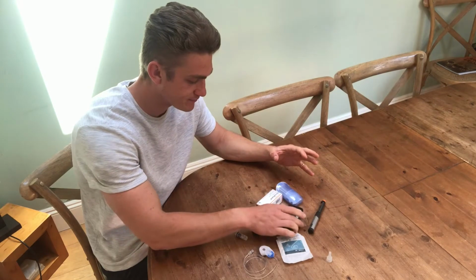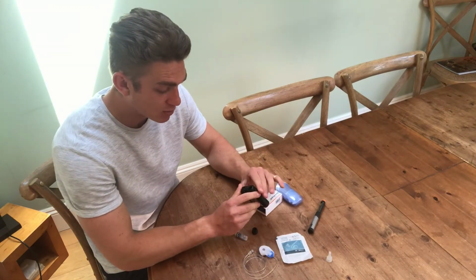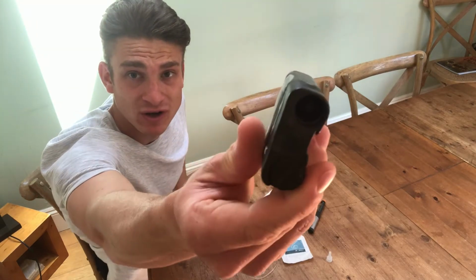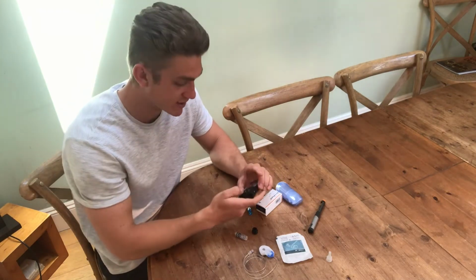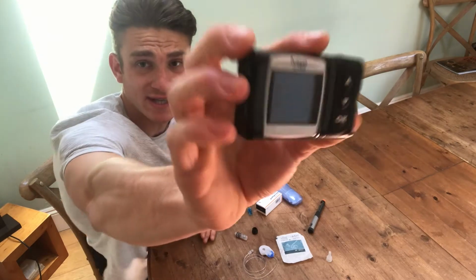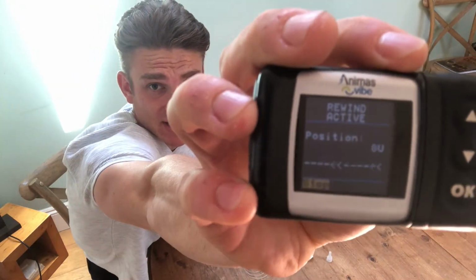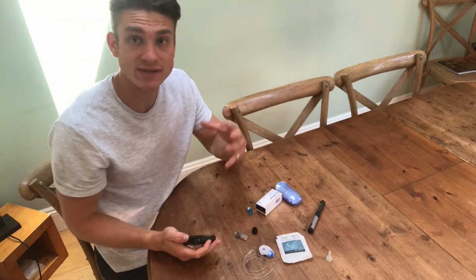So here it is. To start with, for the pump I need to be able to make room in this little hole here for the new cartridge to go in. So I have to set the pump, and as you can see there, the pump is now starting to rewind backwards from 0 units all the way to 200.